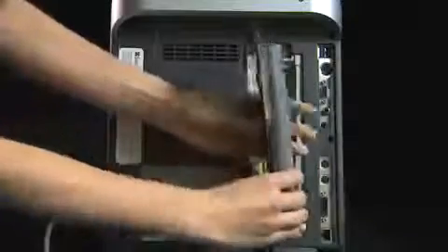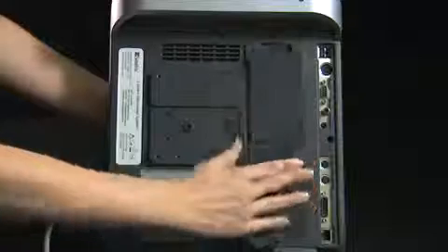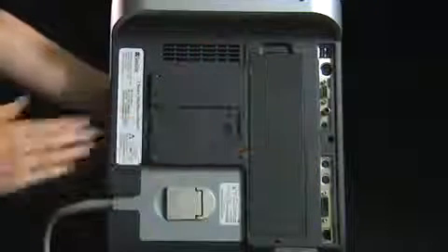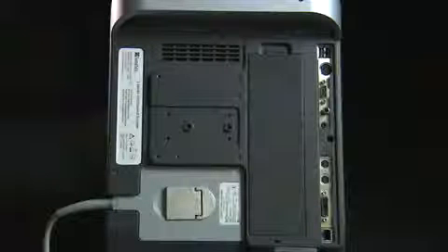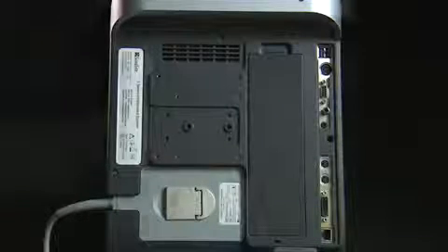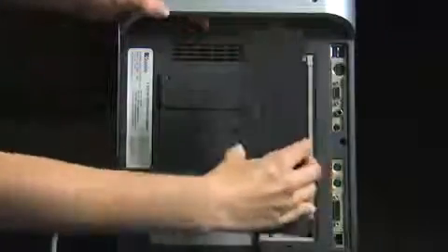The S-Series operates efficiently on either AC or battery power. To install the battery, turn the system upside down. Place the battery into the battery compartment. Push down on the cover until the latch snaps into place. If the battery is being installed for the first time, it will need to be charged. To remove the battery, push up on the locking lever and lift the battery from the compartment.